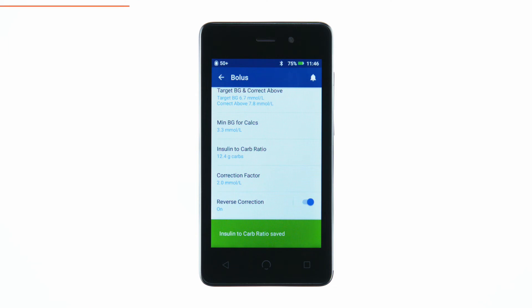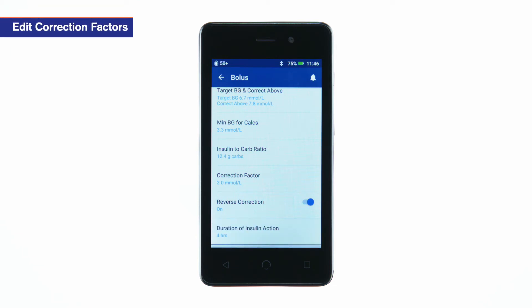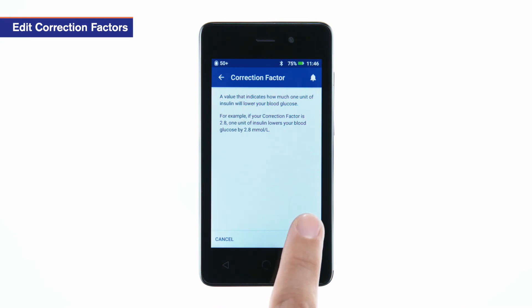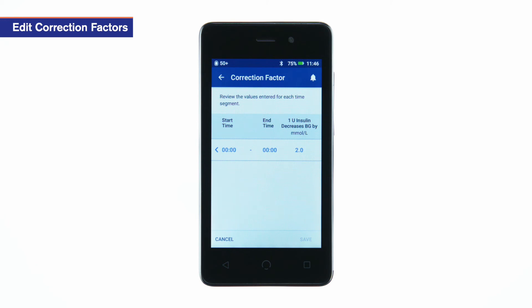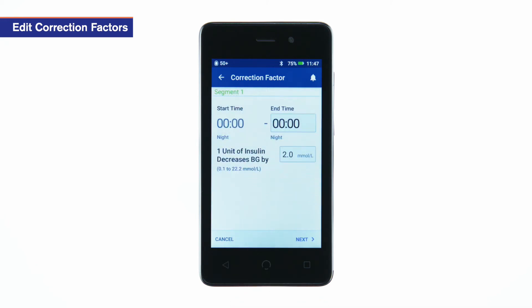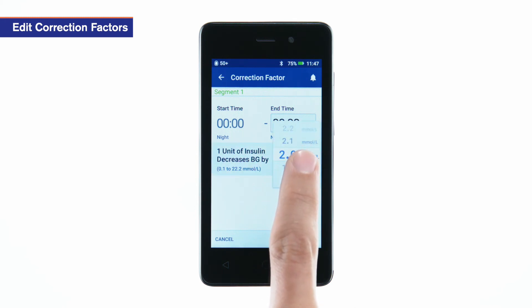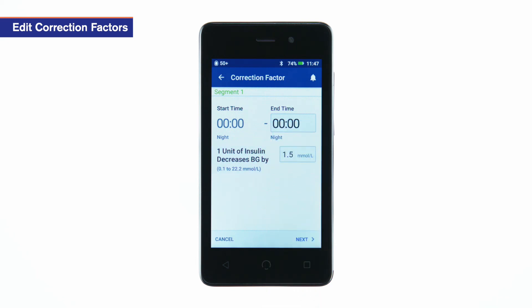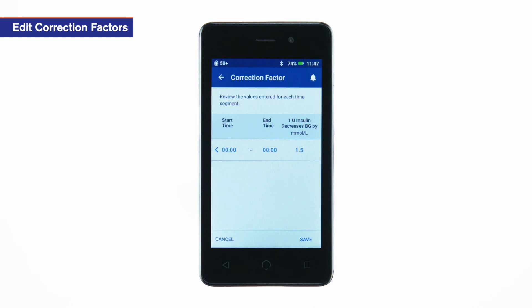To edit the correction factors, tap correction factor. Review the description of correction factor and tap next. To edit a segment, tap the row containing the segment you want to edit. Edit the end time and correction factor. Repeat these steps as needed for the remaining segments. After confirming all segments are correct, tap save.